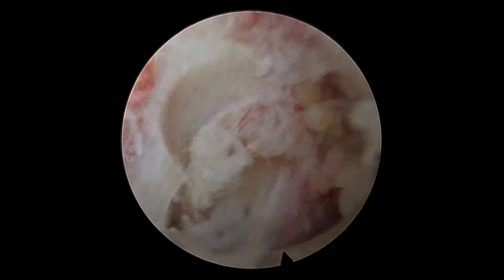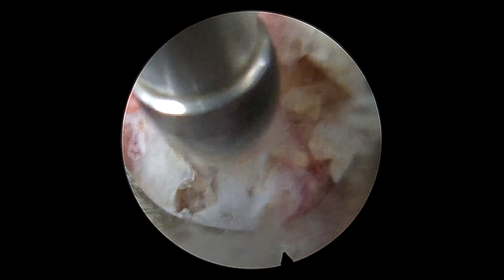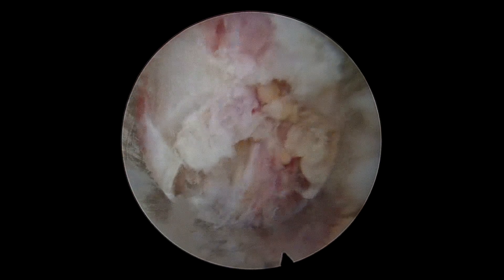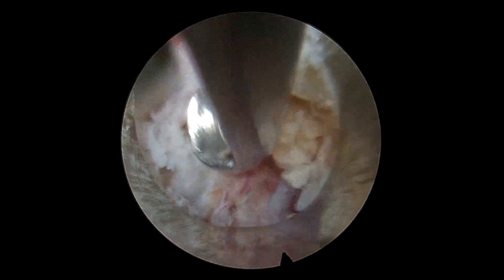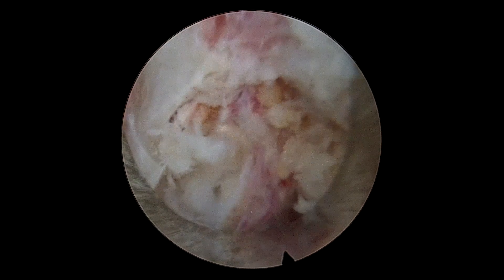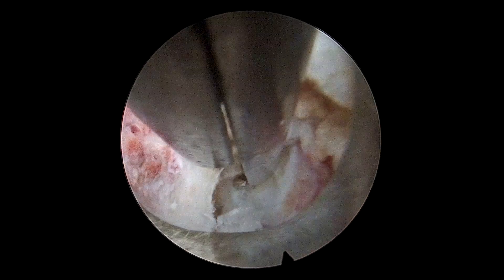So one has to be extremely judicious. Once the drilling was completed, we started decompressing the root. We used Kerrison rongeurs and removed and upcutted the superarticular process anterior part.